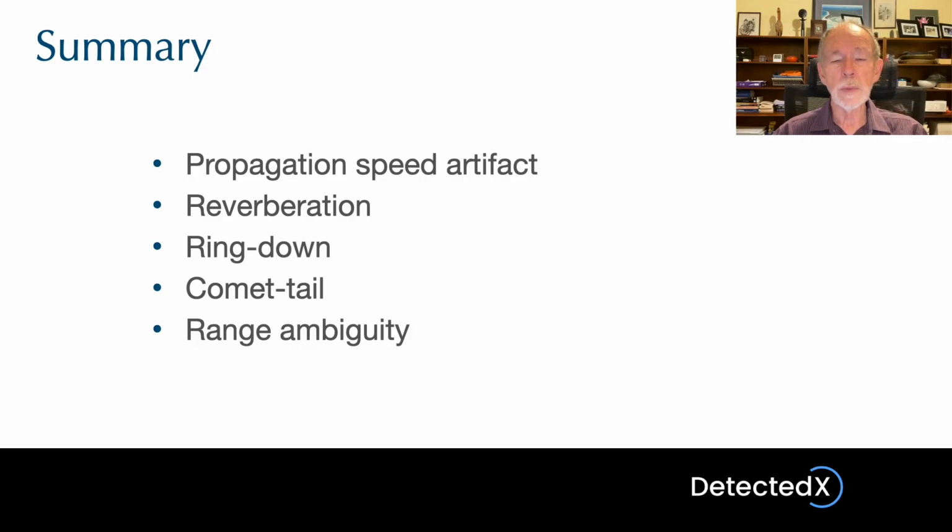Remember that reverberation is caused by ultrasound reflecting backwards and forwards between parallel tissues which are approximately perpendicular to the beam direction. One of the ways to minimize reverberation is to tilt the probe so the beam is no longer striking the tissues at perpendicular incidence.